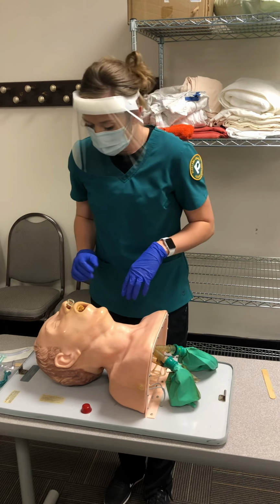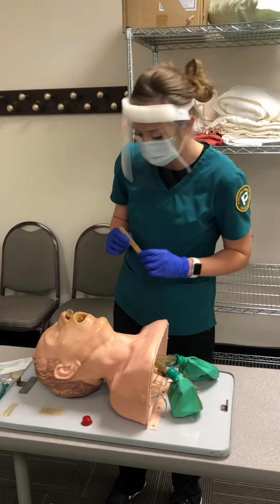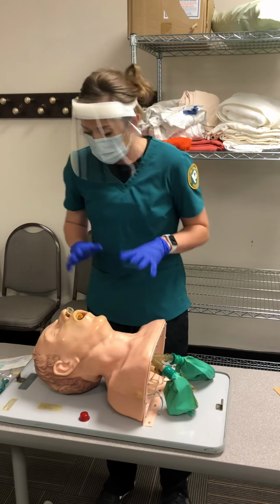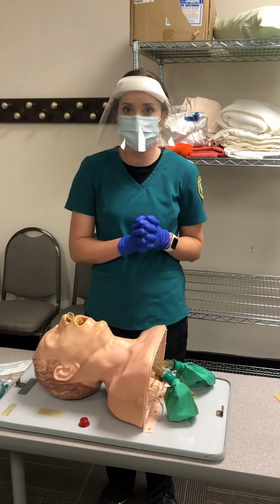Once it is in, I will visualize to make sure that it is placed correctly. I can use a tongue depressor to move the tongue out of the way. And then I will again assess the patient's vitals and document this in the patient chart.